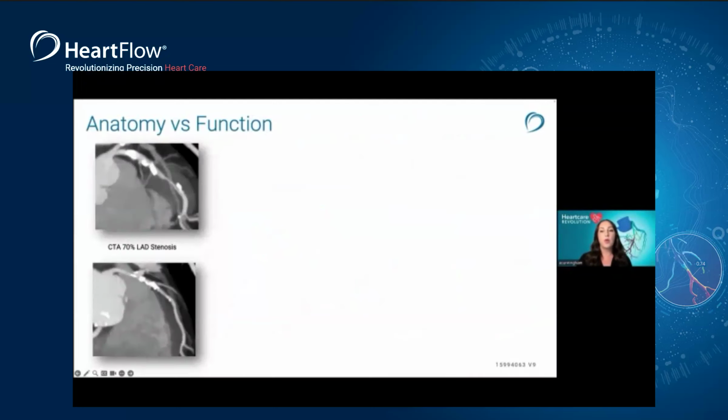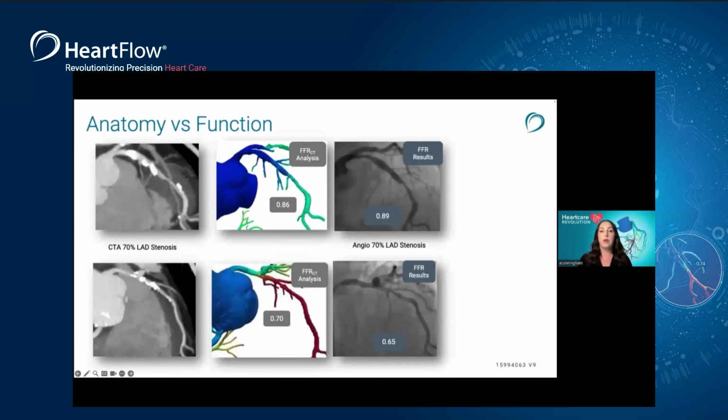In these examples, coronary CTAs were ordered based on patient symptoms presented to their physician. Based on anatomical results, both patients had a high-density calcified plaque with 70% stenosis in the proximal LAD. Additional testing was recommended to evaluate the hemodynamic significance of the findings. Functional data could be assessed invasively with FFR in the cath lab or non-invasively by submitting the coronary artery images to HeartFlow for FFRCT.